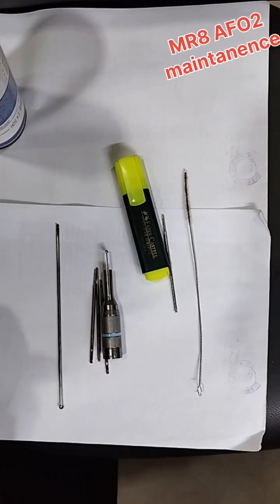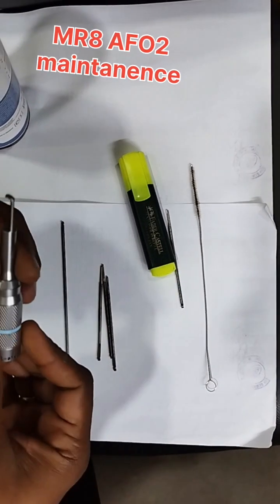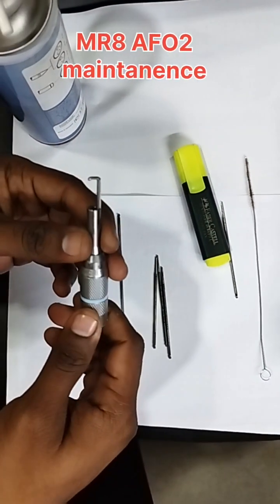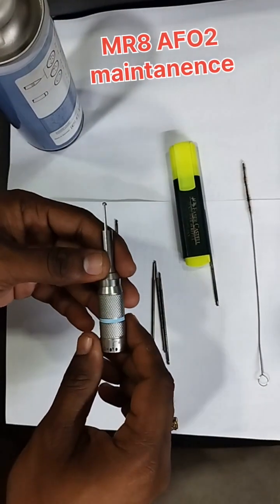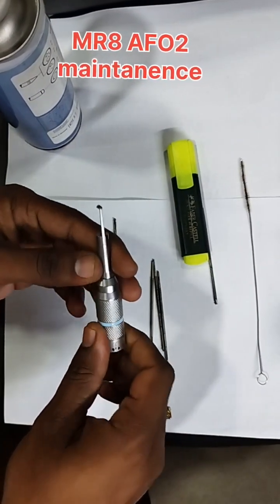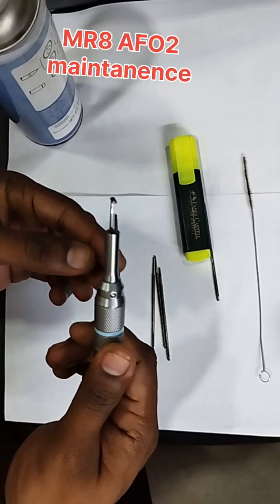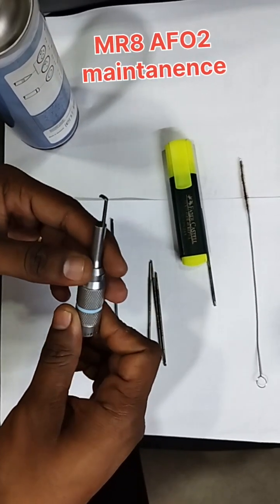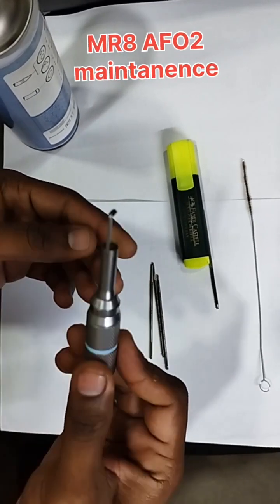Good evening friends. Today I'm going to show you how to check this attachment — this is the craniotomy attachment from Medtronic. Many surgeons are using this, but most of the time OT people or technicians who are cleaning and maintaining it don't know how to maintain it properly. This is a very essential tool for doing craniotomy and it is purely based on our maintenance.